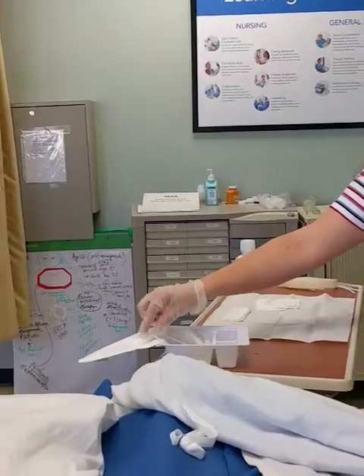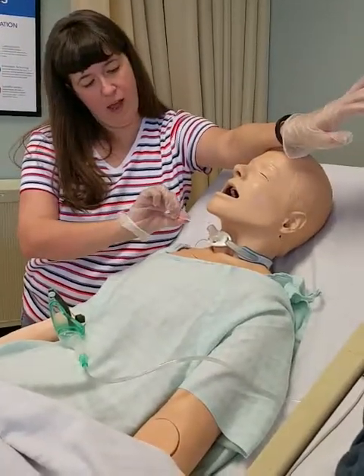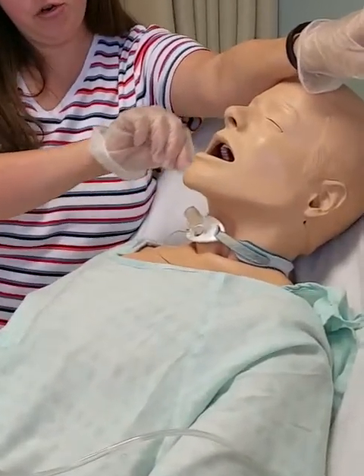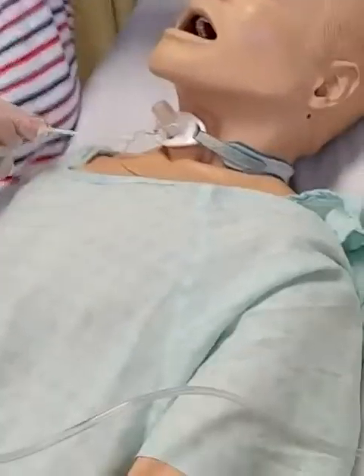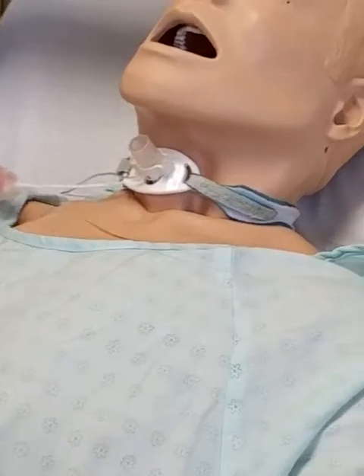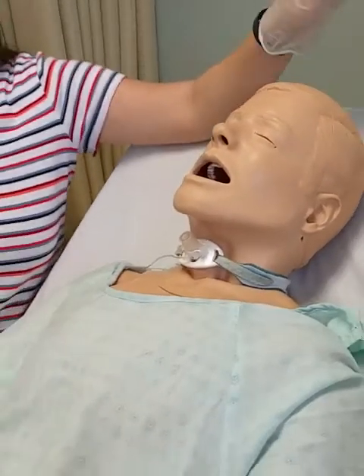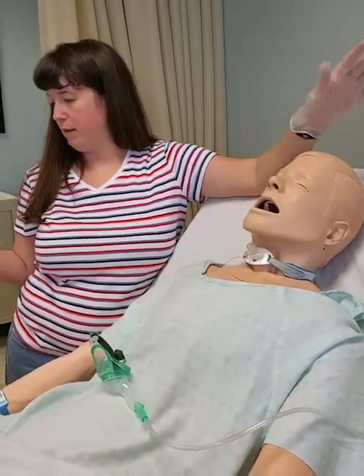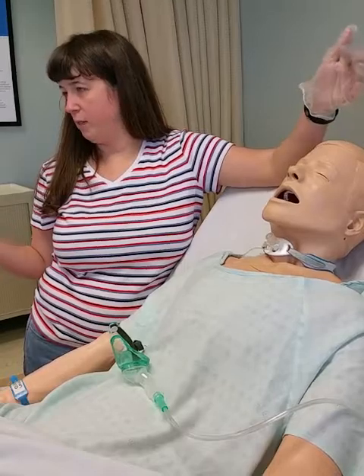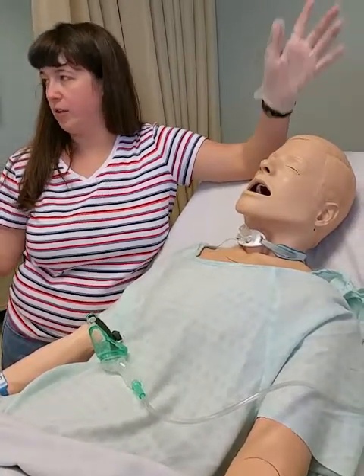Hydrogen peroxide. Half moon underneath the faceplate. You want to get down around the edges of that stoma with the hydrogen peroxide and throw that in the garbage. Now, there's a huge debate about which way to do this. As long as you rinse with saline when you're done with hydrogen peroxide, it really doesn't make a huge difference. I do all my hydrogen peroxide first.